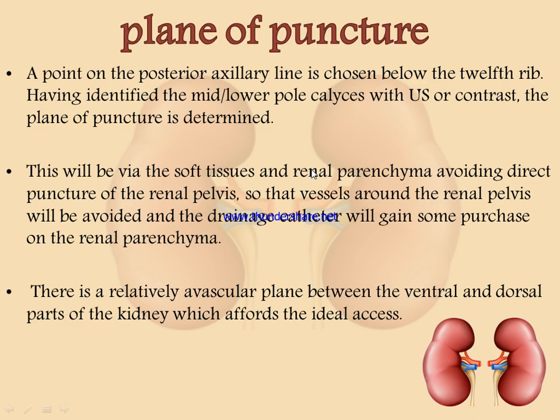The plane of puncture is a point on the posterior axillary line, also chosen below the 12th rib, having identified the mid-lower pole calyx with ultrasound or a contrast.